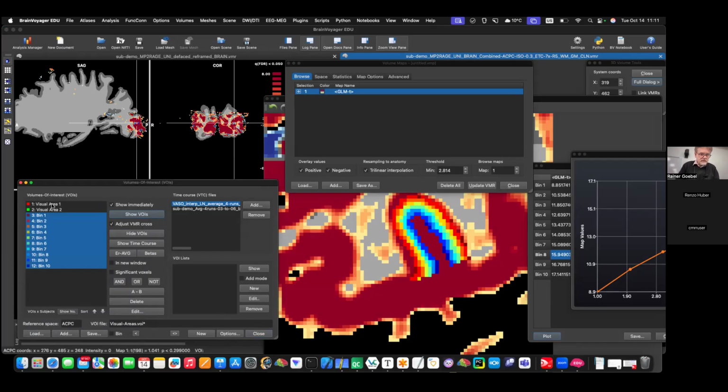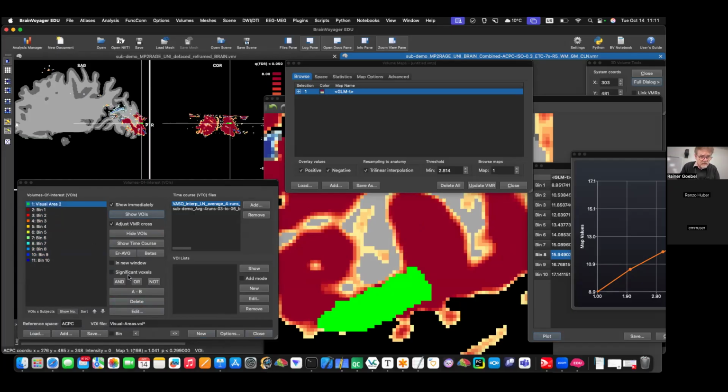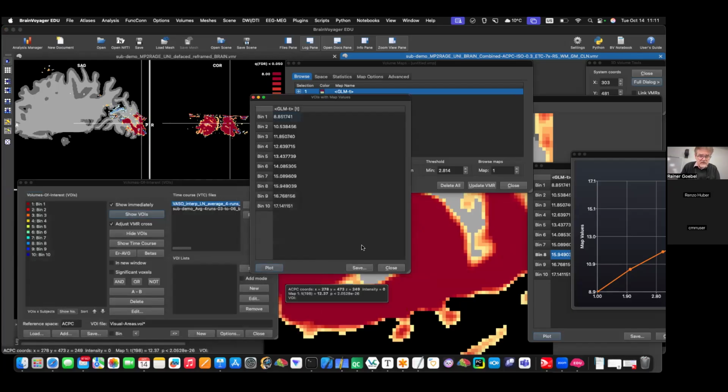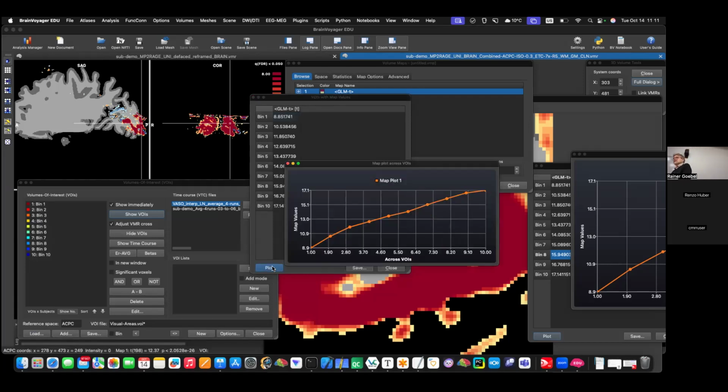So now let's have a look. The first two I should remove, otherwise you get a bit confused. Let me go here and make a plot in these guys. Both are over 2 hours, randomly selected, not selected by the calcarine. This is a little, two slices on top of the calcarine. So maybe there you get even stronger effects, and maybe a middle peak, but here not.